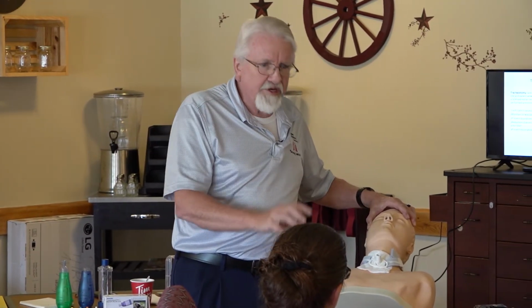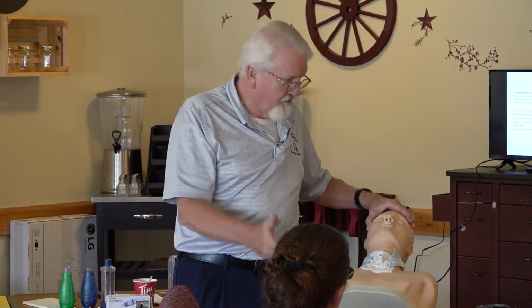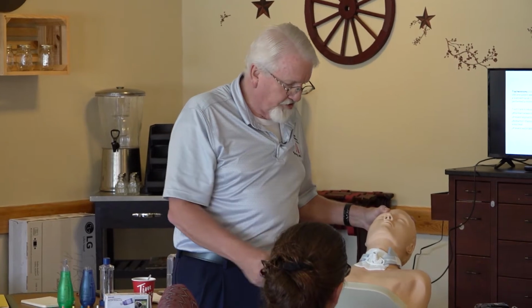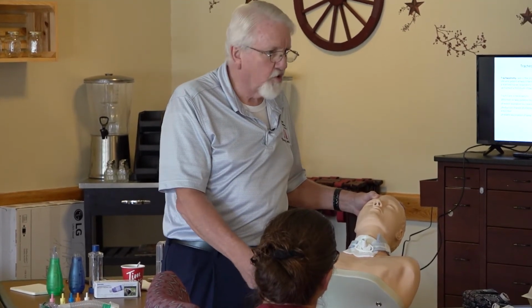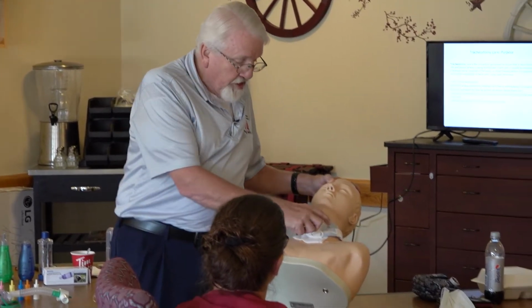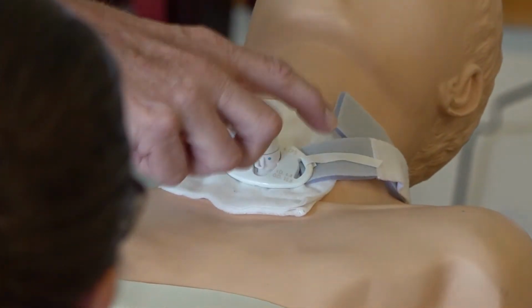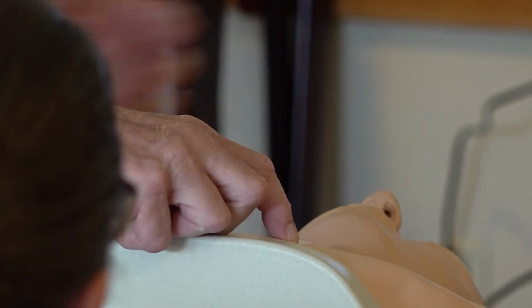We've got everything. We've gone through all the formalities of what we need to go through. So I'm going to get ready to do my trach care. He's already got his pulse ox on. And so the first thing I'm going to do is he's on oxygen. So I'm just going to move my trach collar to where I can, I don't have one up.